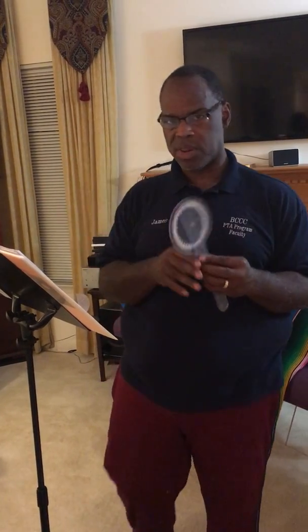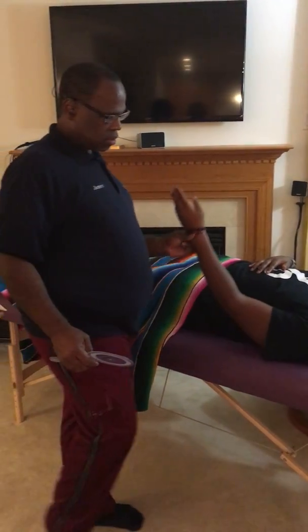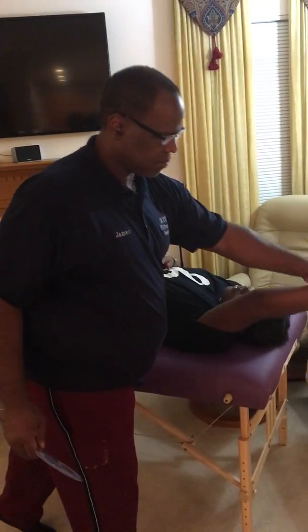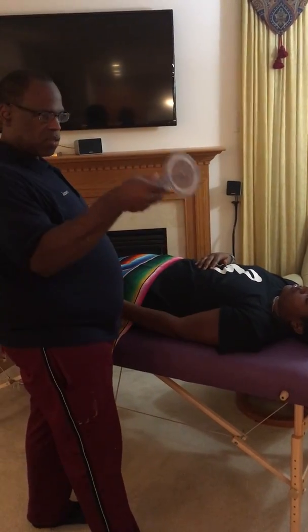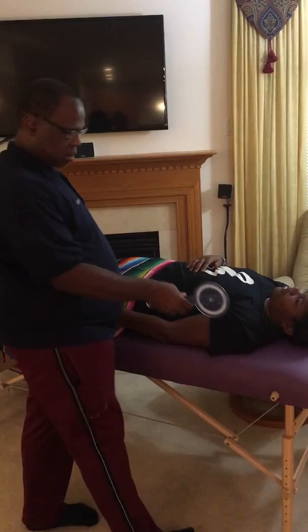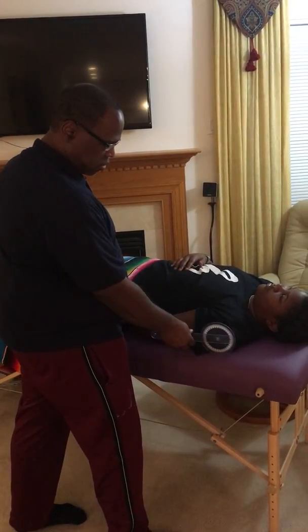So let's just show one example. If we're looking at shoulder flexion, this is considered shoulder flexion. With the goniometer in neutral for the closed position, this is the closed position for shoulder flexion.